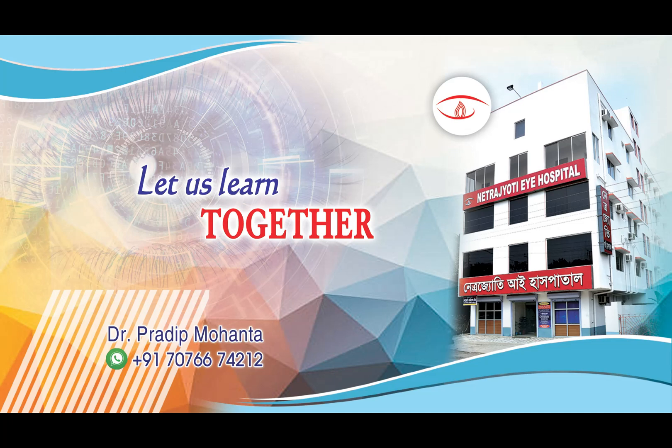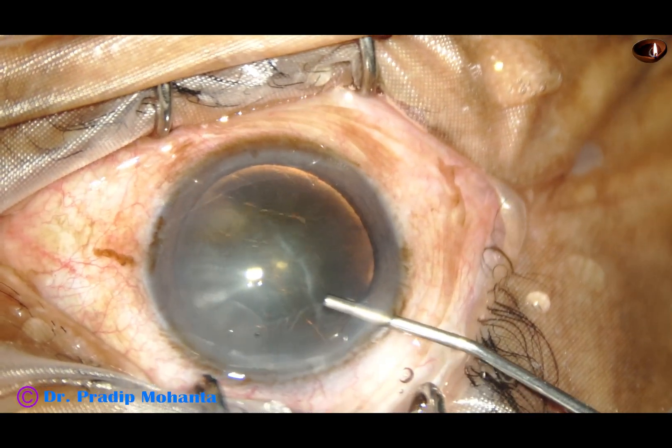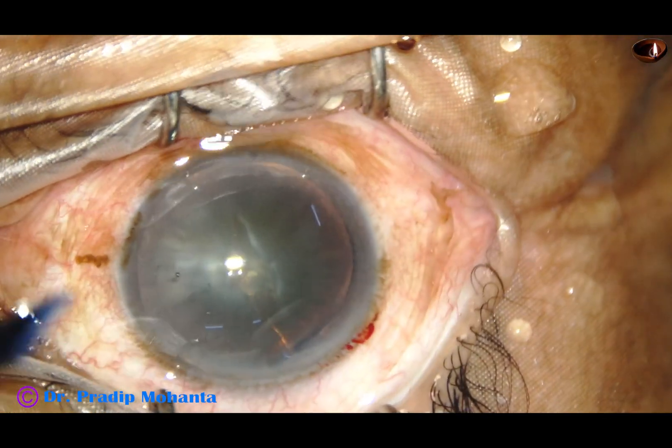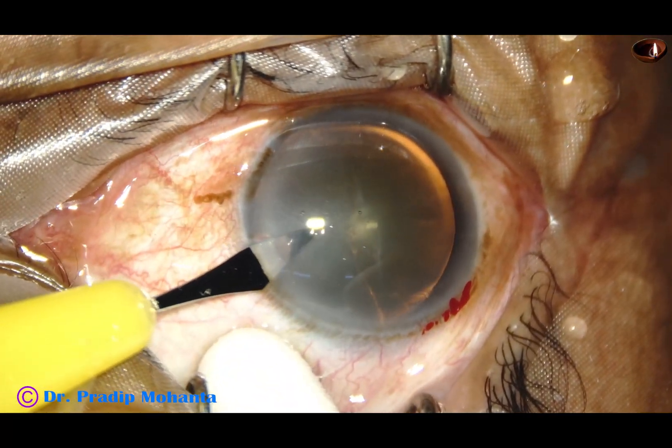Friends, welcome to my workplace at Ranaghat, West Bengal, India. Let us learn pre-chopping in soft cataracts. In this video, I have described the hand movements in very slow motion, at 25% — that is one fourth of the normal speed. Please watch this video and learn pre-chopping.